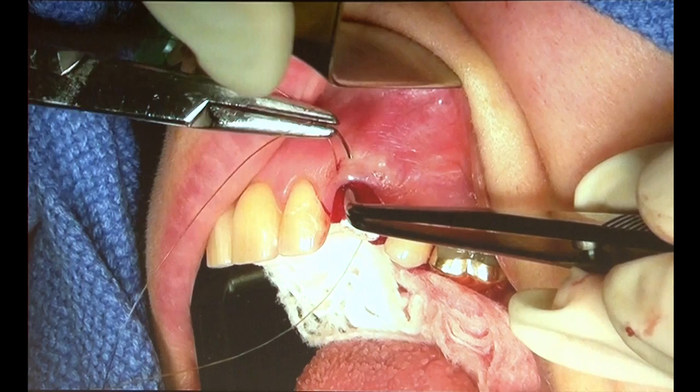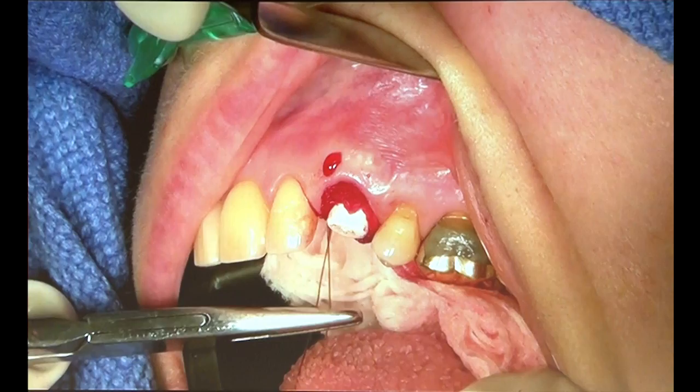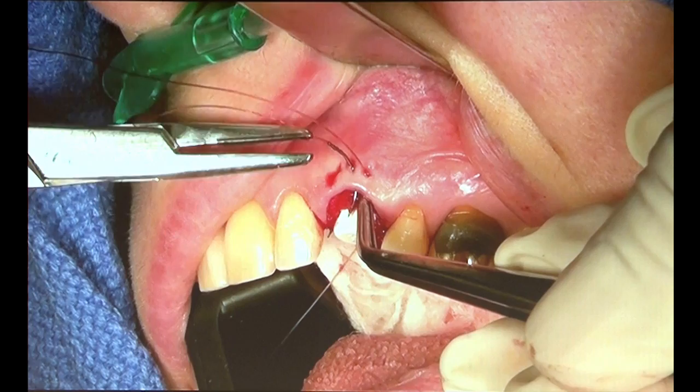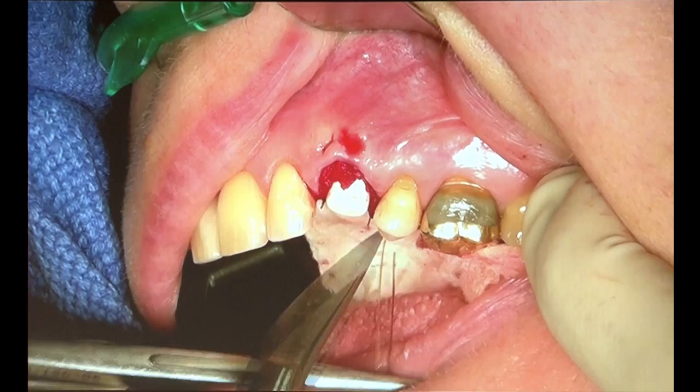Just completing the suturing. And then going to the distal. Now you can see the collagen matrix absorbing the blood, therefore helping us to stabilize the blood clot, especially around the cervical margin of the restoration that will be placed. So we'll finish suturing, and if there's excess collagen material, it's okay because it will resorb over time anyways.